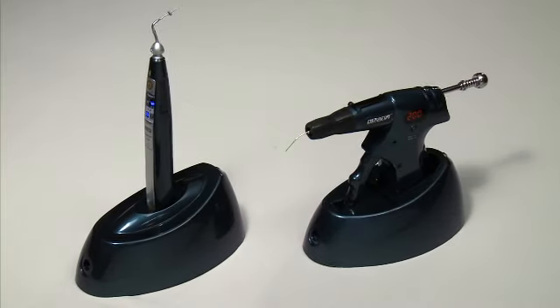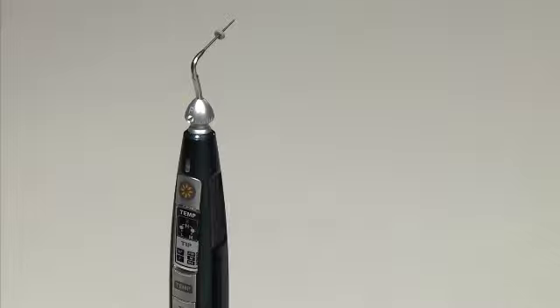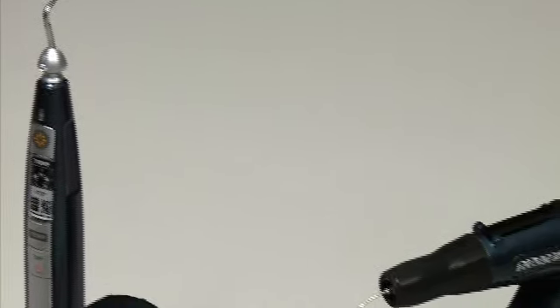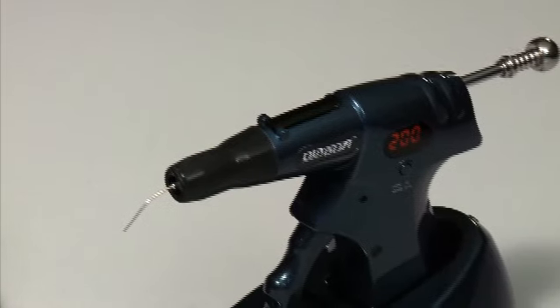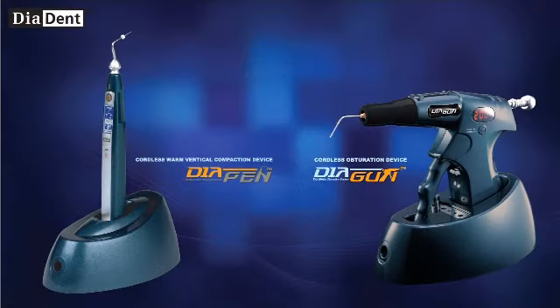Using both Diapen and Diagun together is a very effective and reliable obturation system. With its ergonomic cordless design, Diapen and Diagun offer unparalleled performance of both warm vertical compaction and obturation.